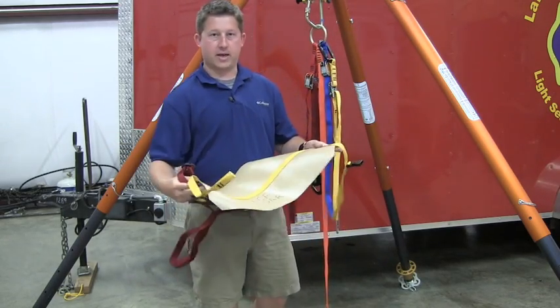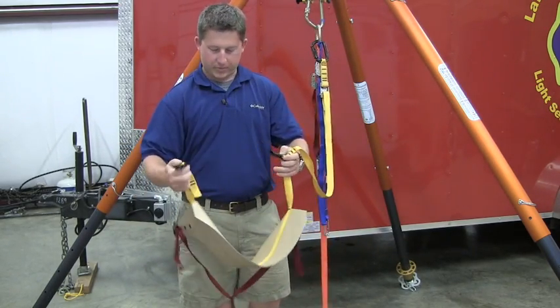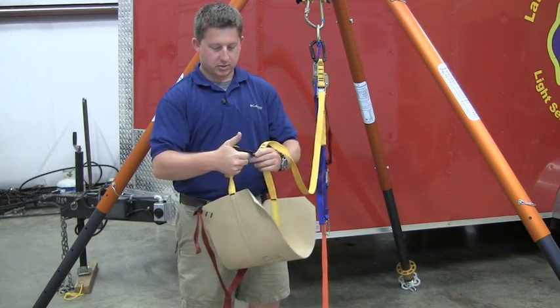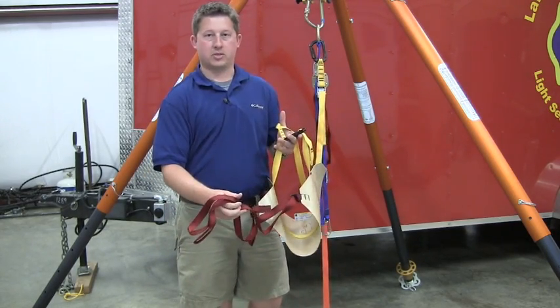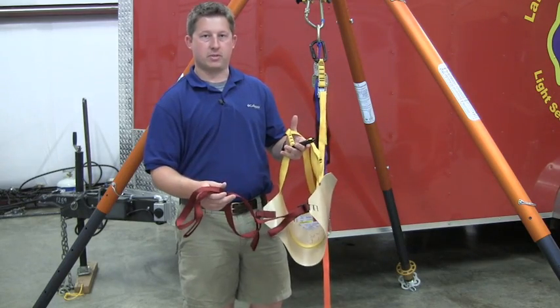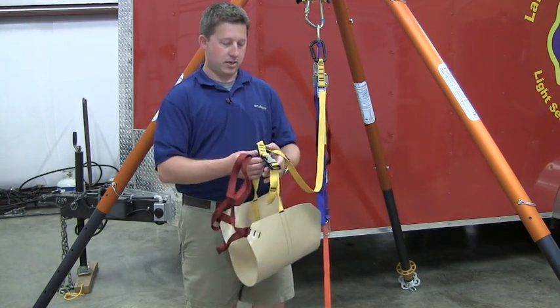And then this basically acts as a catch for their feet. It has a strap that goes around their ankles and connects. And then you'll have basically foot stirrups that you can use to put on the patient's feet so that it keeps their feet in the right position. But this lets their feet come up and it lets them lay supine and keeps them level.